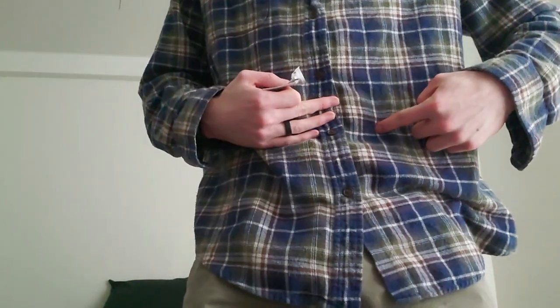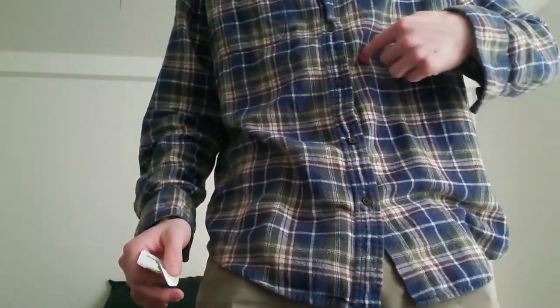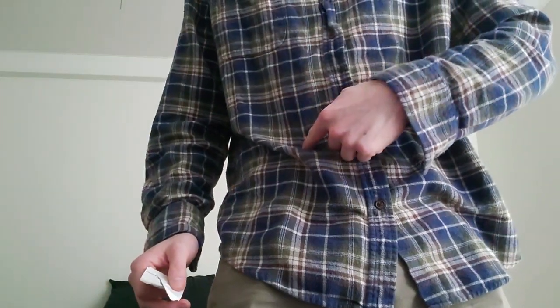Typically the way I do it is just in my stomach. What I do is I start at the bottom, work my way up my stomach, and then I work my way down. That way you're using a different insertion point every single time. If you use the same point every single time, you're going to cause bruising. Also, injecting into the same spot over and over, it can cause scar tissue, right?